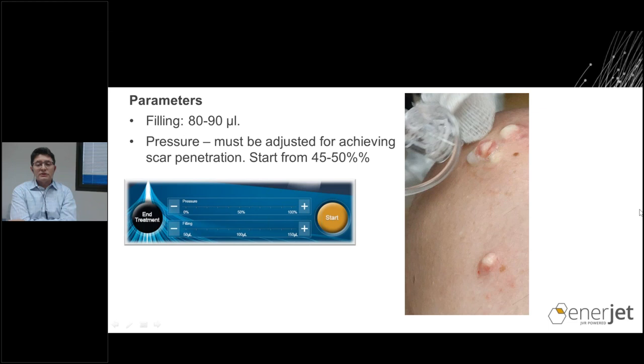Regarding longevity of cross-linked HA and non-cross-linked HA, we did not conduct any specific study looking at longevity of effect. For atrophic scars, once you have a correction of the scar or remodeling, improvement of the appearance of the scars, there is no reverse effect, so it's hard to say the longevity.